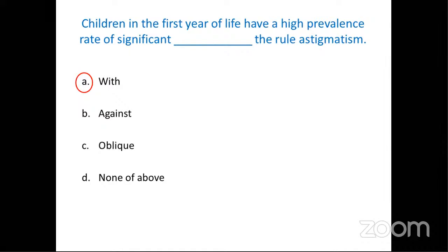After cataract surgery, or sometimes, you have to make an incision. Forget about suture. When you are doing a cataract surgery, you have to make a small hole, right? You have to cut the cornea and make a small hole. When you are making a small hole and putting the device inside the anterior chamber of the eye, the preferred position of making the small hole is from the 12 o'clock or 1 o'clock position, right?